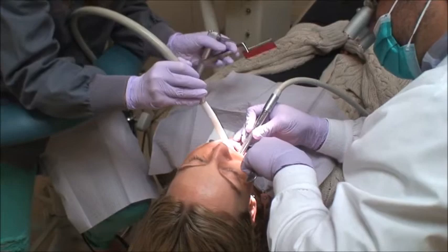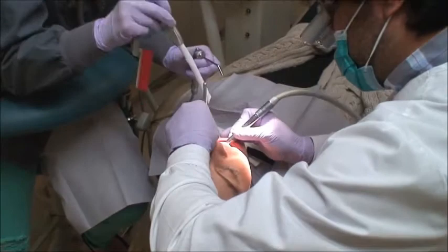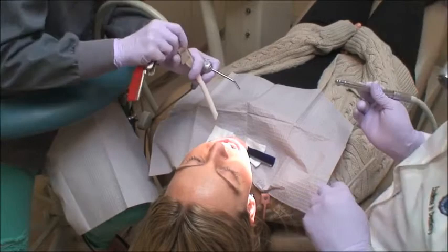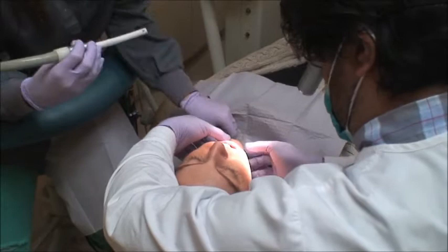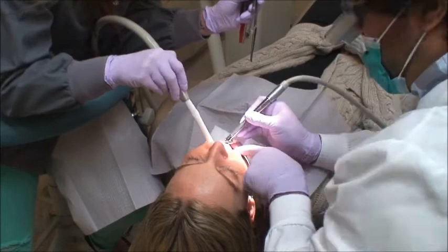My goal during a bite adjustment or equilibration is for things to go fast and predictably. Now I'm asking the patient to grind her teeth — we're checking for laterals and protrusive movements. The assistant is suctioning to make sure there's no saliva in the mouth, then places the plier while I hold my mirror in one hand and my drill for adjustment in the other. For a CR situation, the steps are essentially the same: the assistant covers half the mouth fully with the plier while I make adjustments. The handpiece runs without water so the teeth stay dry.